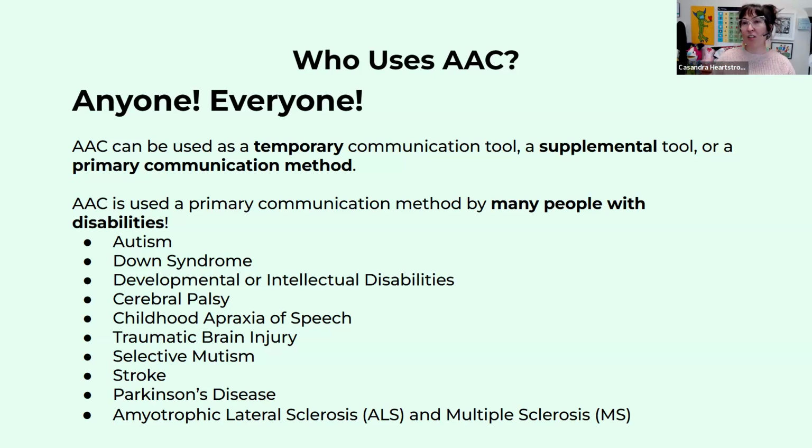Or for students who, when they get really overstimulated, they stop talking. This can be a supplemental tool for them too. Or our students that it's a primary communication tool. So it can be applicable to all of those different cases. It doesn't necessarily have to be a permanent solution. It can be something that is short term.